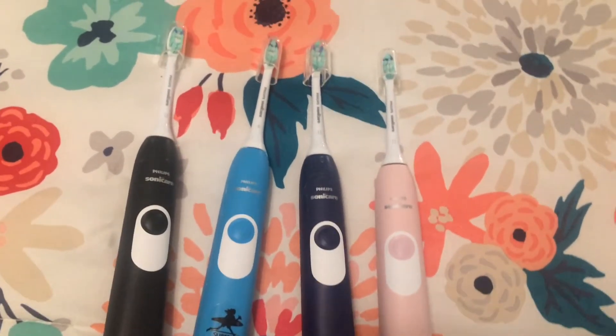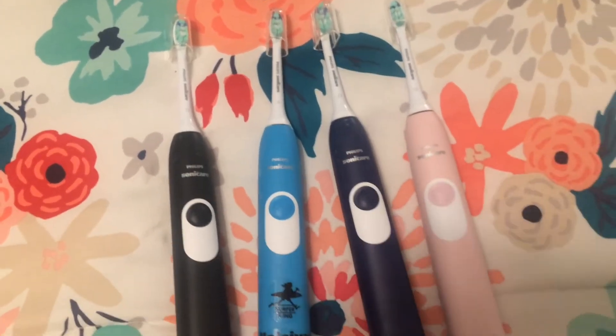So these are the colors that they come in. There's black, blue, navy blue, and pink.